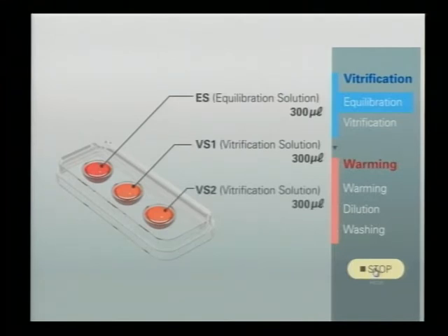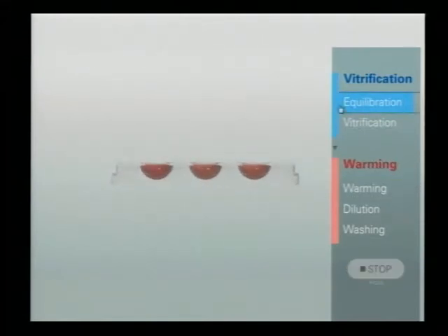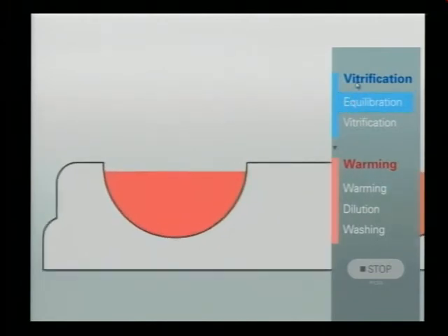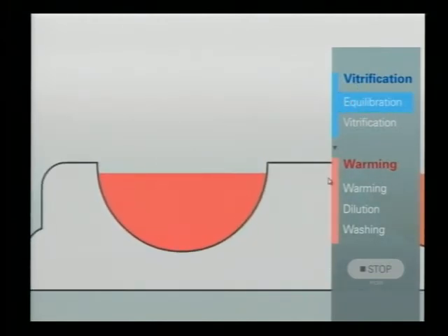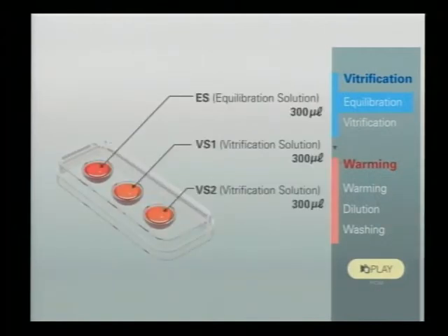So we first fill the first well with incubation solution, like 300 microliters of the incubation solution in the first well, and also 300 microliters of the incubation solution in well two and three. This is the same solution in the vitrification plate.